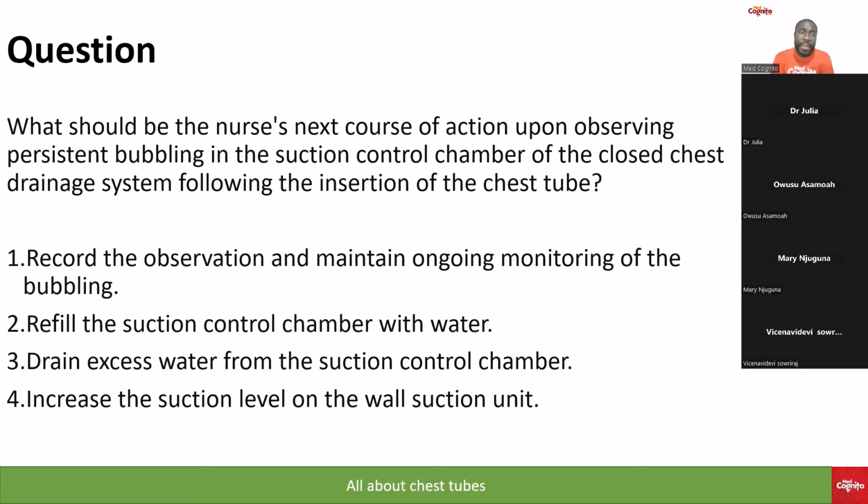Record the observation and maintain ongoing monitoring of the bubbling. Refill the suction control chamber with water. Drain excess water from the suction control chamber. Increase the suction level.